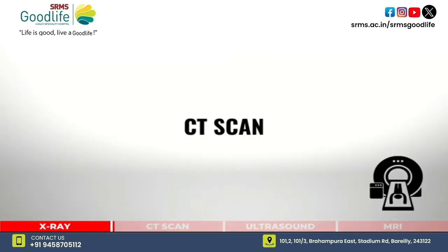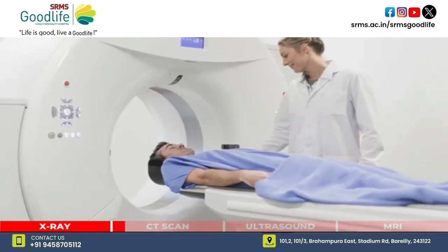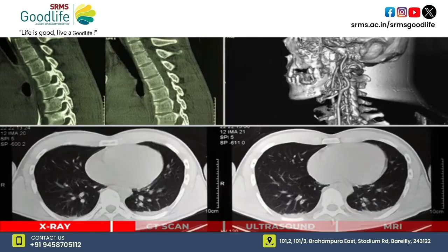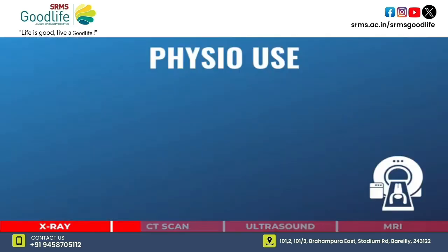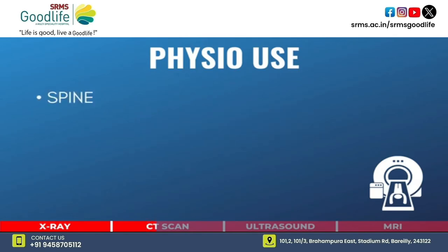CT scan fires a number of X-rays from different angles. It can produce a detailed cross-sectional image of the bone, blood vessel, and soft tissues. Physiotherapists commonly use CT scan to evaluate complex regions of the body. These include the spine, pelvis, ankle, and foot.